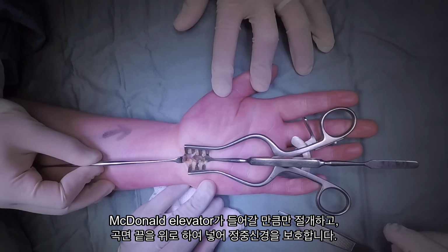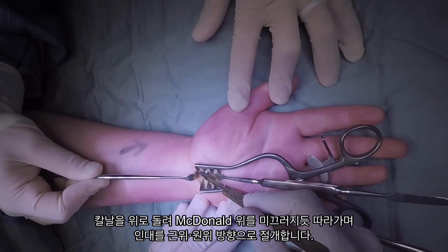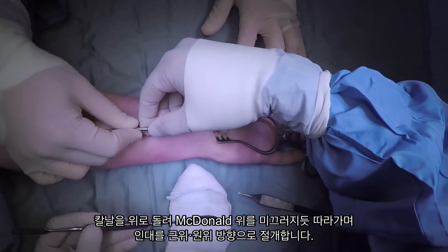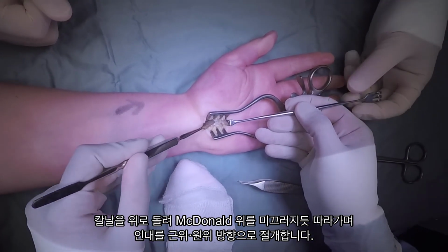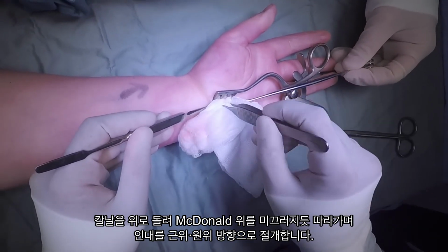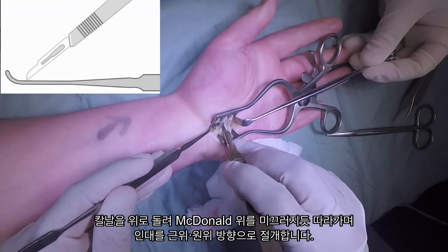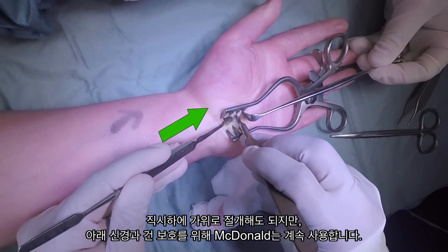Then take your scalpel and turn it so that the blade is pointing upwards. Put the tip of the blade on the McDonald and then divide the ligament by sliding the scalpel proximally along the surface of the McDonald's elevator. Repeat this process to divide the ligament distally. You do have 1 centimetre or so before you get to the superficial palmar arch, but to be safe you don't want to go much further than the limit of your skin incision. To avoid the blade from slipping off the McDonald, feel for the curve at the end to know that you're approaching the tip, or advance the McDonald with your knife.